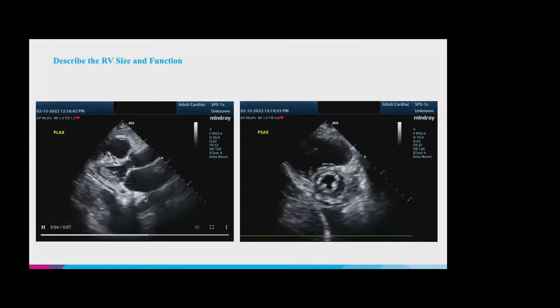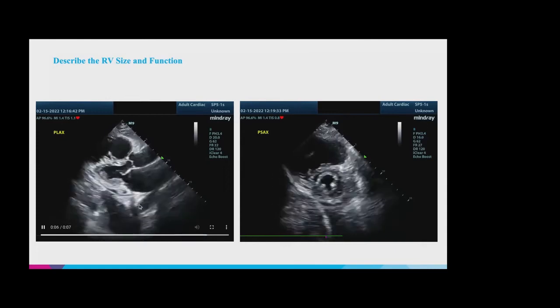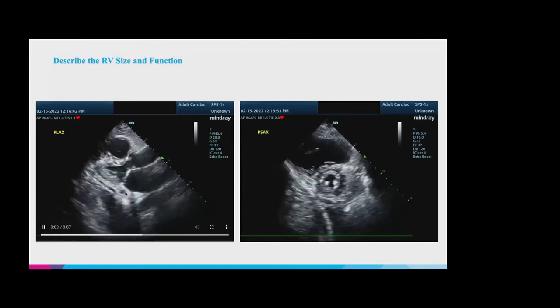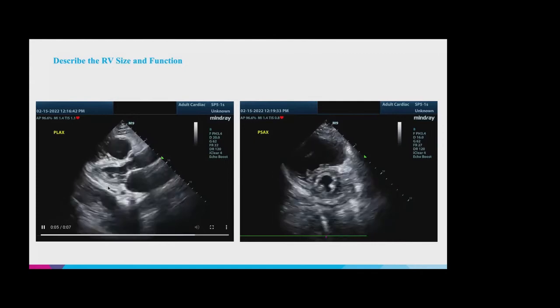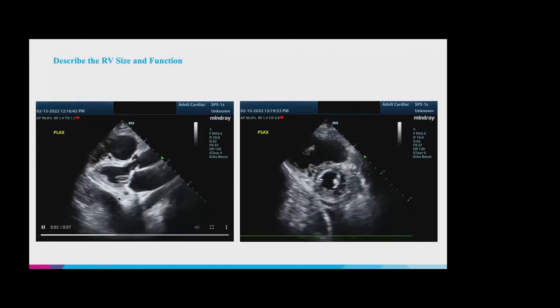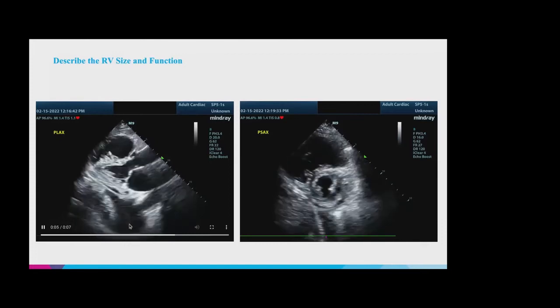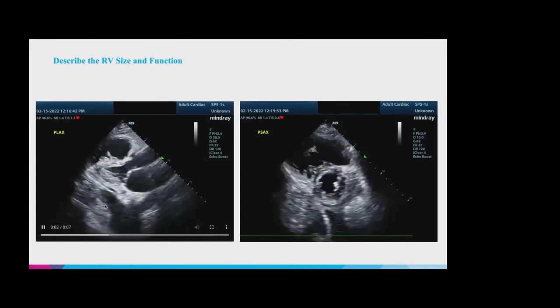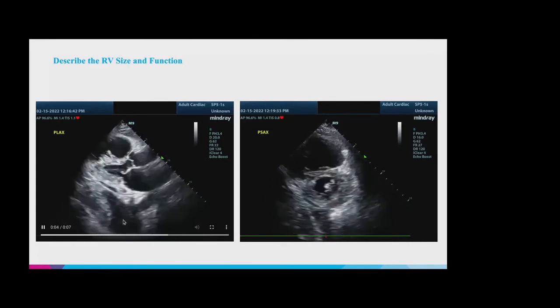It's hard for me to make out the descending aorta. I sort of have to imagine it's somewhere around here. This is probably the coronary sinus, actually, that little dot right there. And then there's a small pericardial effusion right here, and then I think a larger pleural effusion below it. I agree. And then this is just probably some atelectatic lung related to the large pleural effusion.